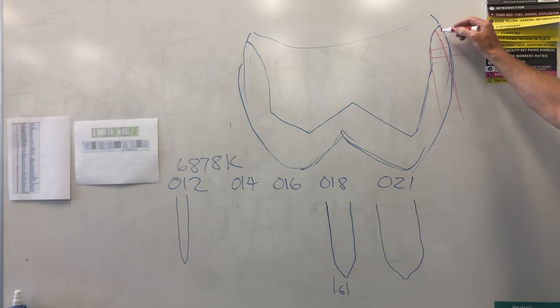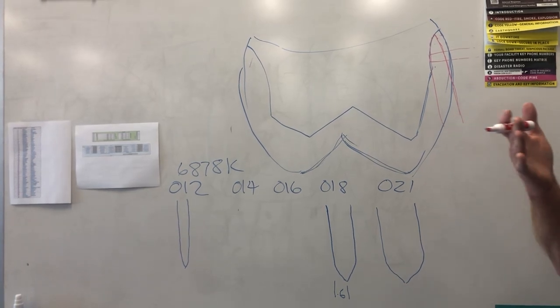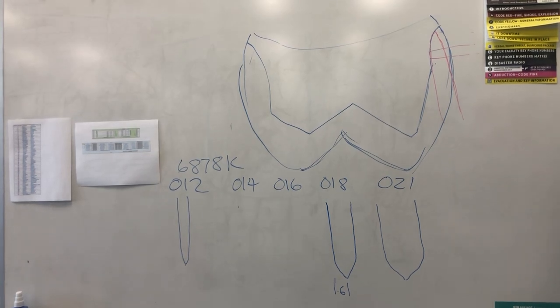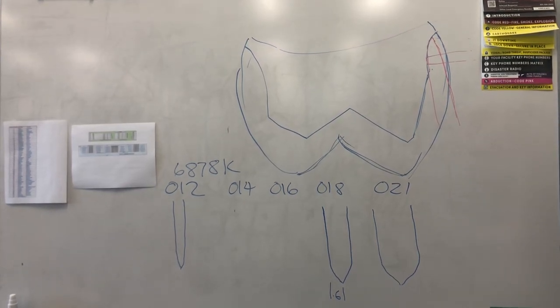And then refining the margin becomes very easy. Sometimes we just take the tip of that burr and just bring it outside the tooth slightly and swipe it across it, and it creates a real smooth margin. If you have any J-lips, it'll get rid of them really quickly.